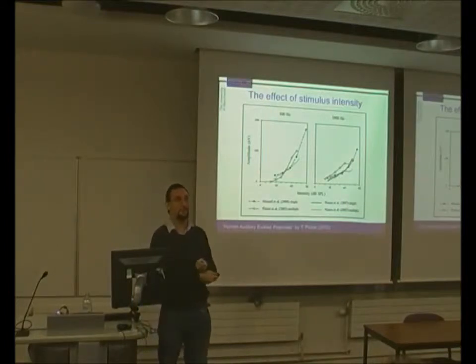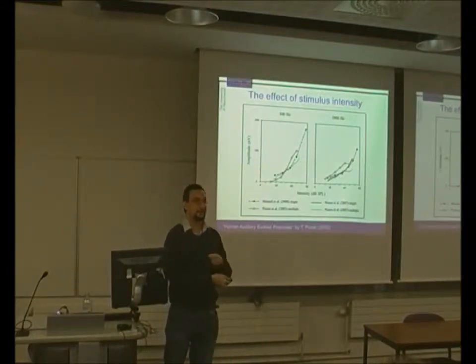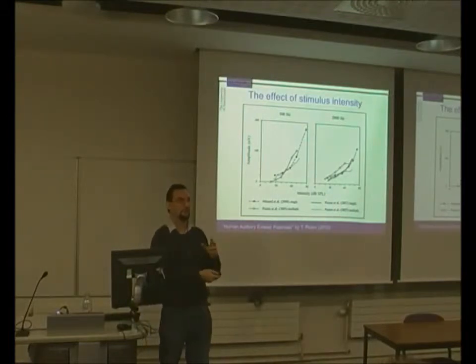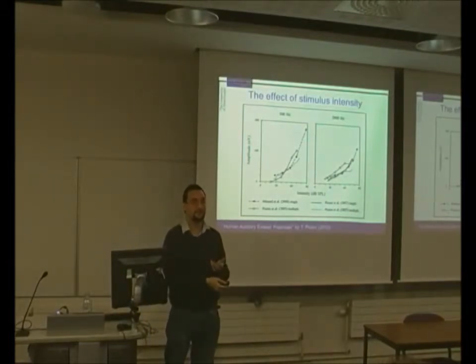So we need to be able to, for the ASSR, be able to detect that the signal is significantly above the noise. So if there's a high level of noise in the recording, then those small responses close to thresholds won't be detectable.